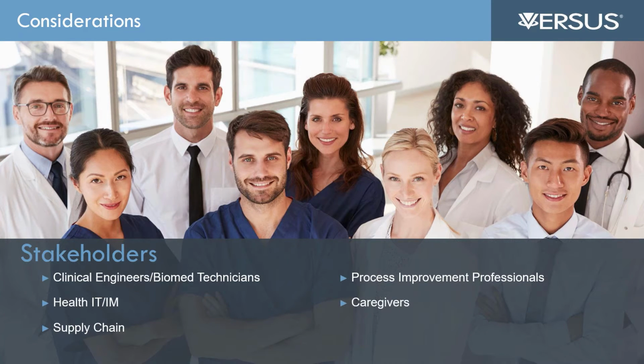And I don't want to leave out our bedside caregivers. Oftentimes I've been in projects where, unfortunately, nurses are sometimes the last ones consulted. That's not always the case, but they're the ones often that are the most impacted by these types of systems and projects. And asset management is no different when it comes to equipment they use on an everyday basis. For example, an IV pump.